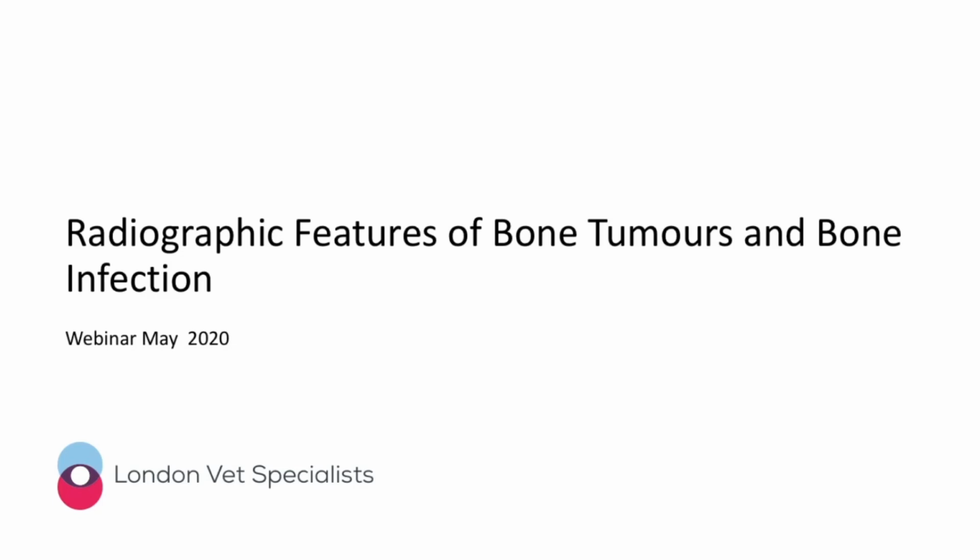Today, we're going to talk about the radiographic features of bone tumors and bone infection.